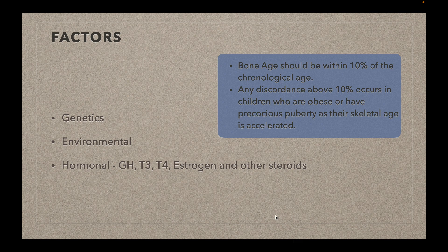Bone age should be within 10% of the chronological age. If there is any discordance above 10%, that may indicate the child is either obese or has precocious puberty, because in those cases the skeletal age is accelerated.